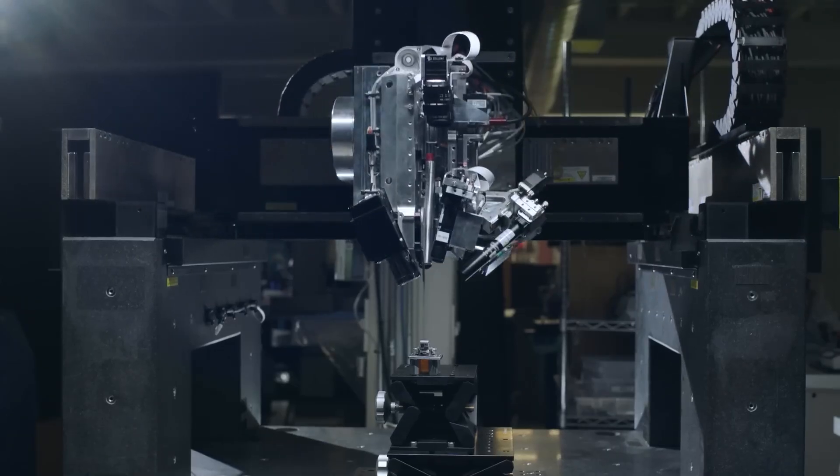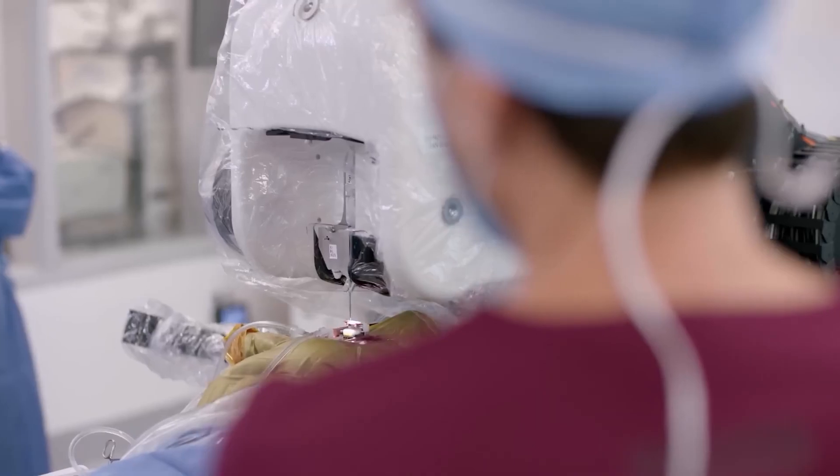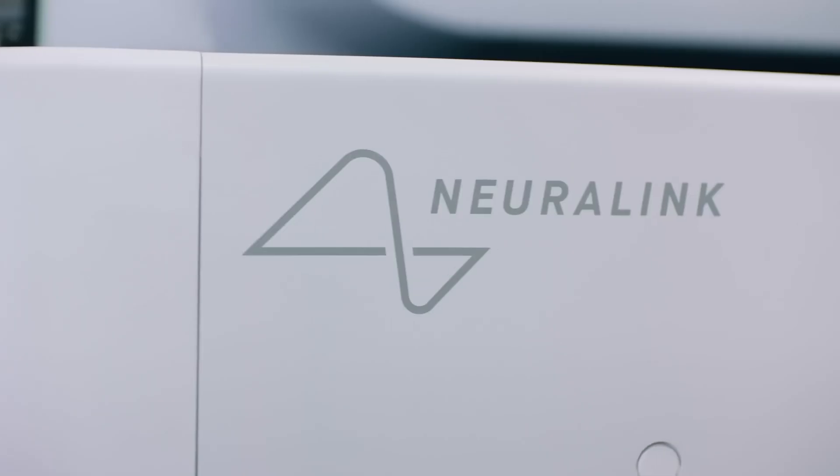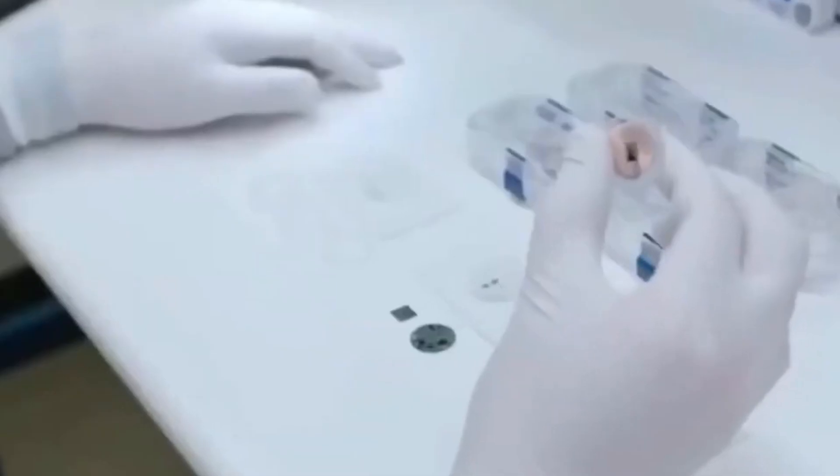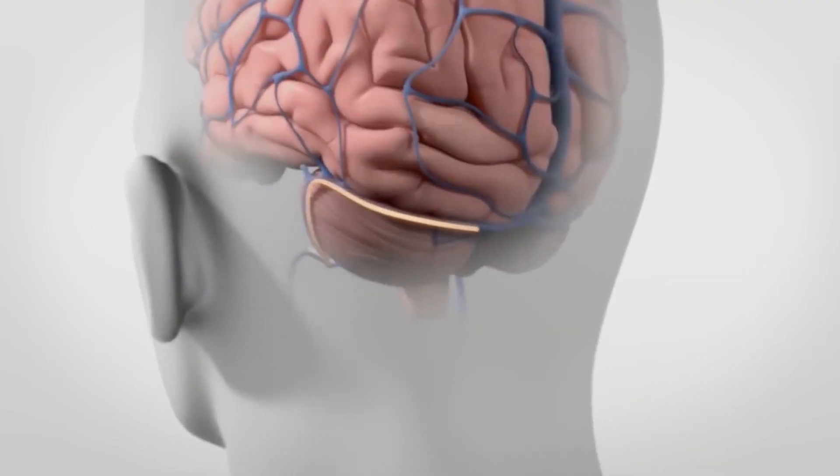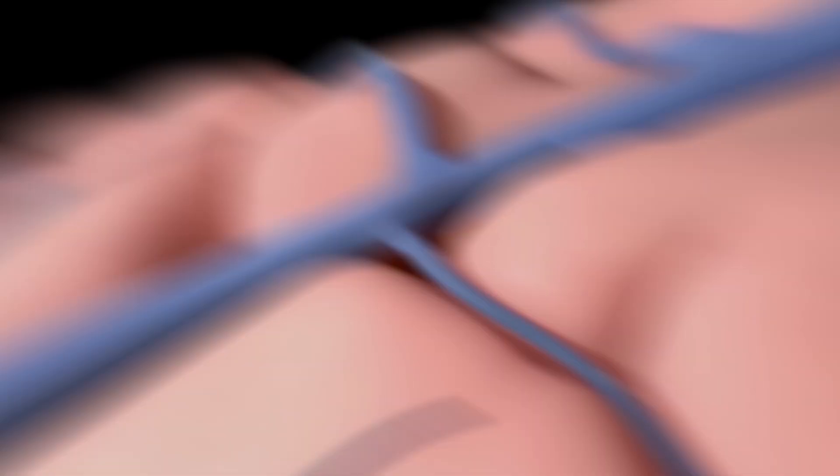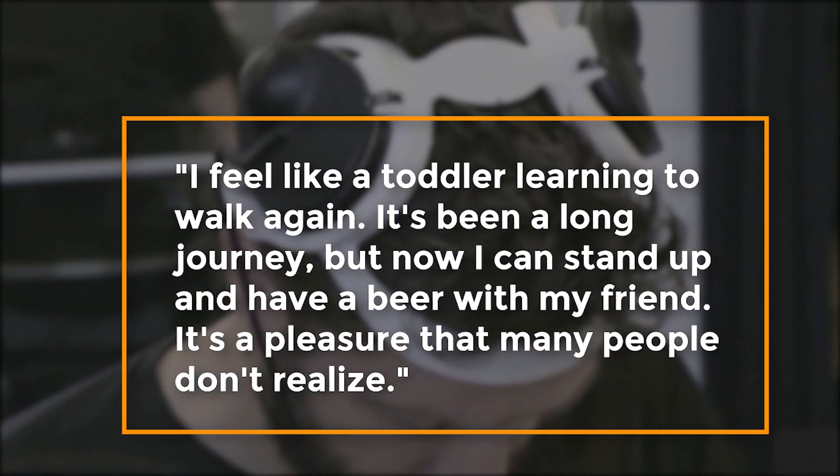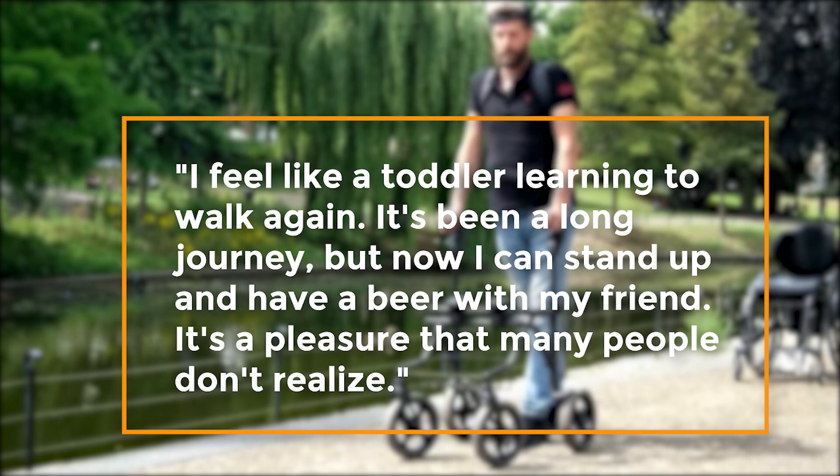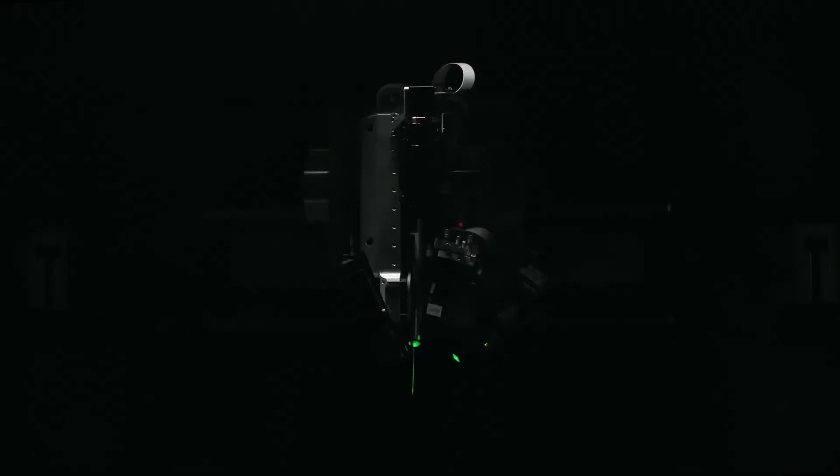A Dutch man who was paralyzed from the waist down has experienced a life-changing transformation through this technology. With the help of electronic implants, communication between his brain and spinal cord has been restored. His thoughts are wirelessly transmitted to his legs and feet through a second implant on his spine. Mr. Gershon Ozcom, the recipient of this innovative technology, expressed his joy by saying, I feel like a toddler learning to walk again. It's been a long journey, but now I can stand up and have a beer with my friend. It's a pleasure that many people don't realize. He can now stand and even climb stairs. It's truly amazing.